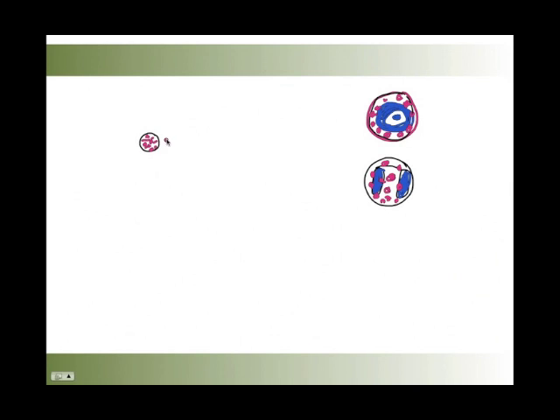So what could this be? Could it be a mast cell? Well, the answer to that is yes. And the reason it could be a mast cell is it could cut through here. So we don't actually see a nucleus, but we see a cut through part of the cell. Could it be an eosinophil? And the answer here is also yes. Making a cut through here would allow us to see something like that. So this question doesn't really have an answer. It could be both, and therefore we can't identify it.